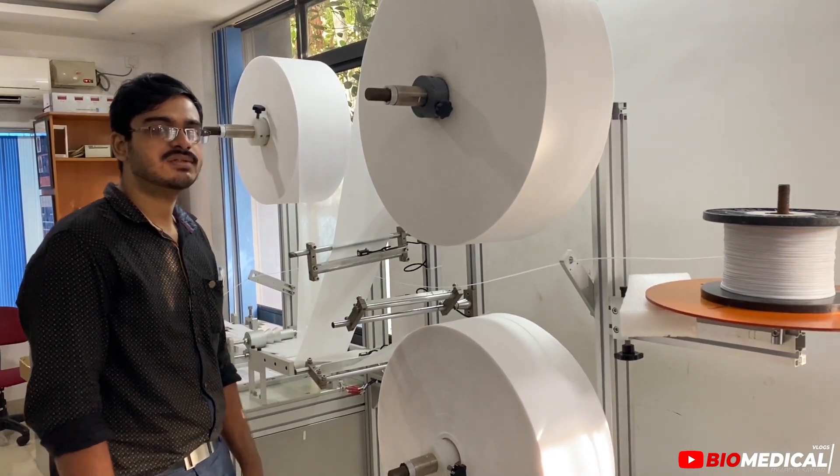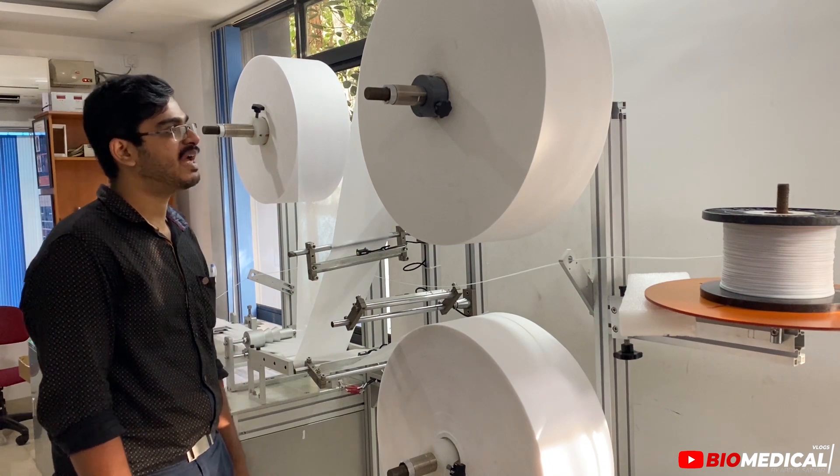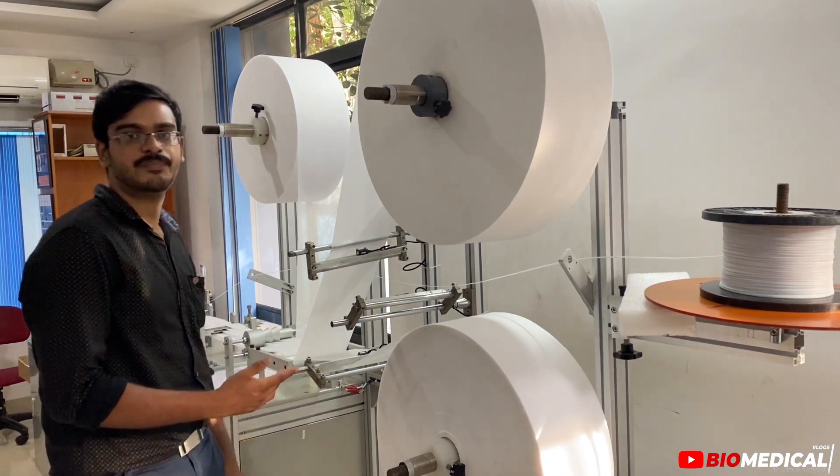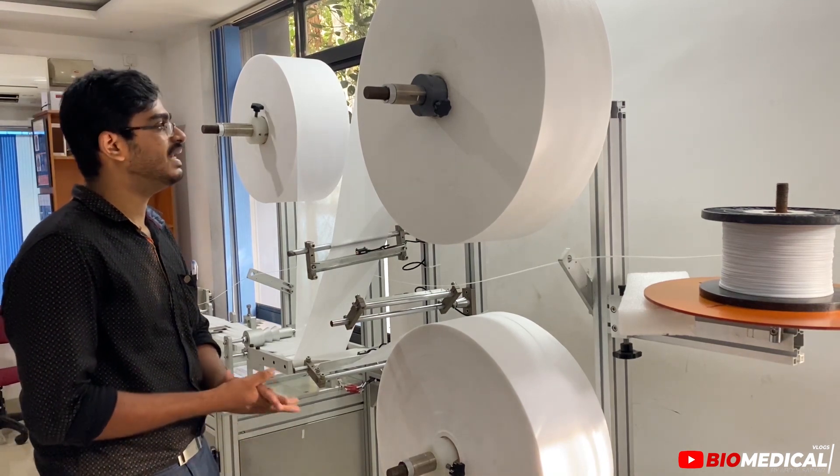This is Sarjaas from KB Antigua. This is a small manufacturing unit for the 3-ply surgical mask. In the 3-ply surgical mask, there are 3 layers.